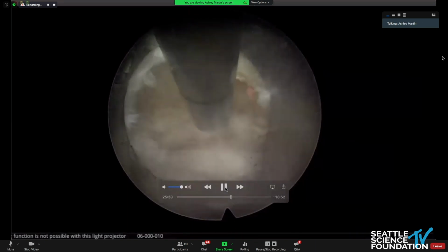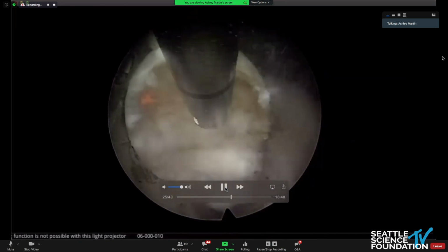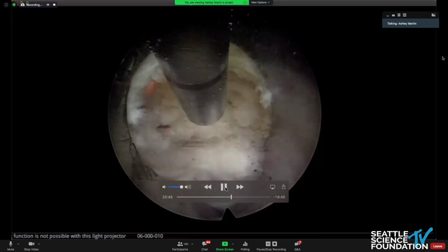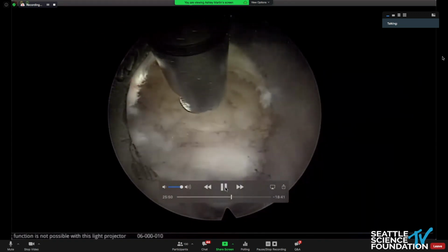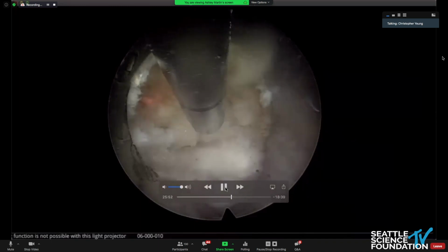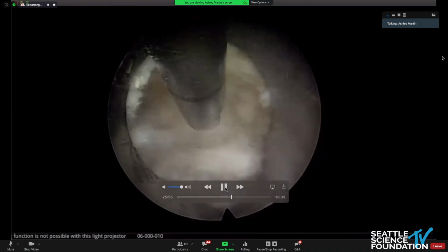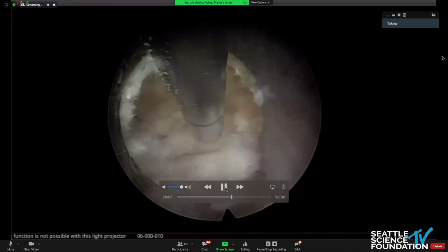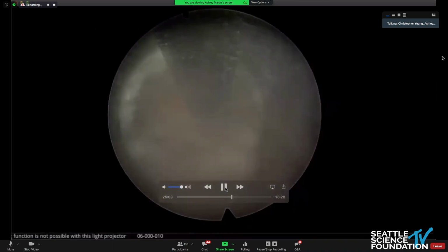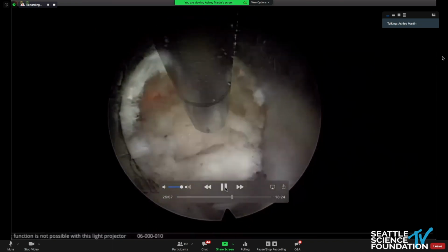So again, this is not what we'd call laser surgery. This is just another tool to help accomplish our goal of decompression. We use a laser because it's harder to use the bigger tools. It's a nice high-tech one, but again, not totally needed. It's really just a luxury, and it works much more efficiently for certain things like this.